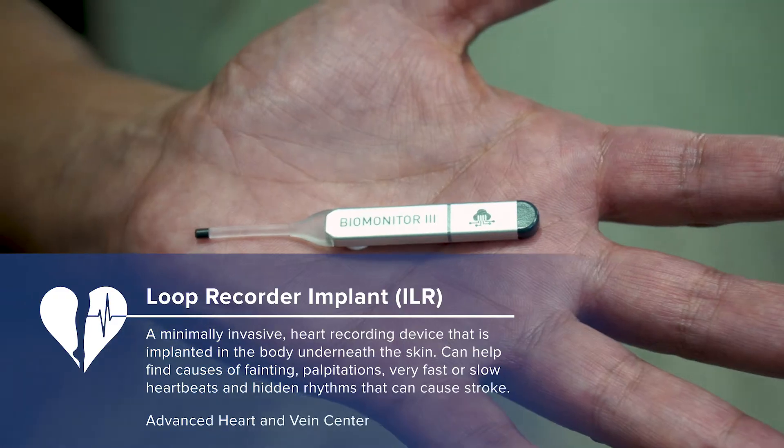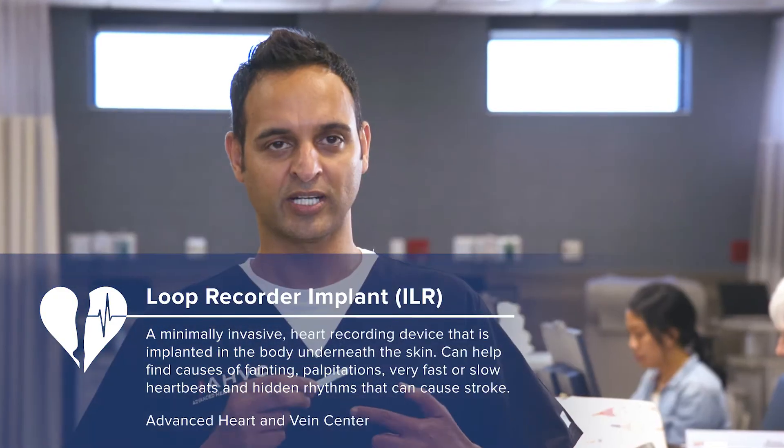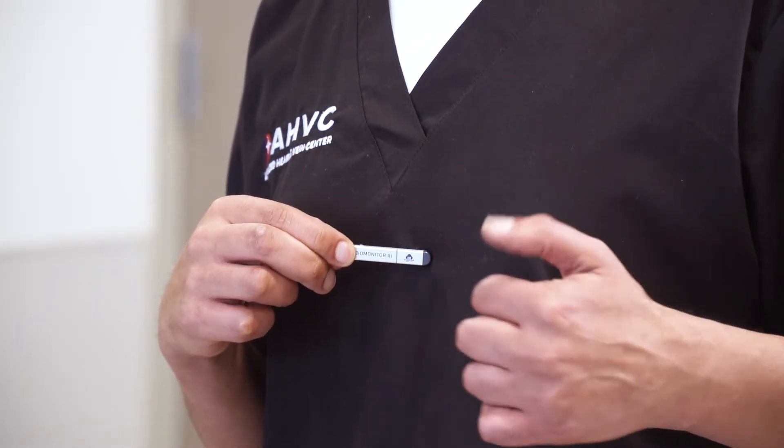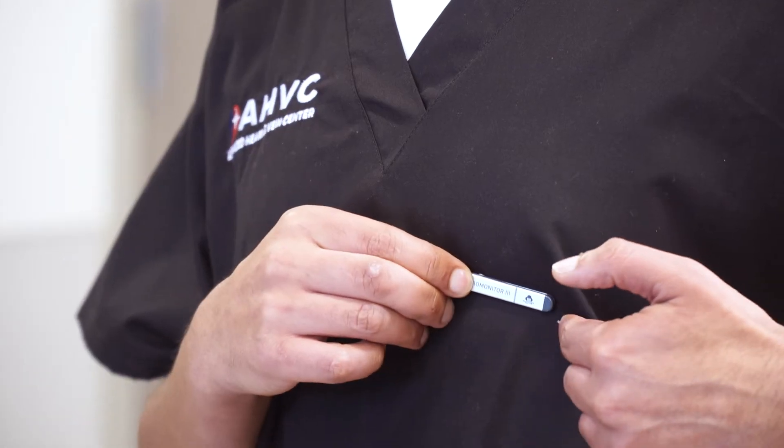It's a rhythm recorder that is implanted under the skin. Usually it goes along the left parasternal area below the breast tissue. We create about a half a centimeter incision along the left parasternal area and insert this under the skin like an injection, and the skin closes itself.